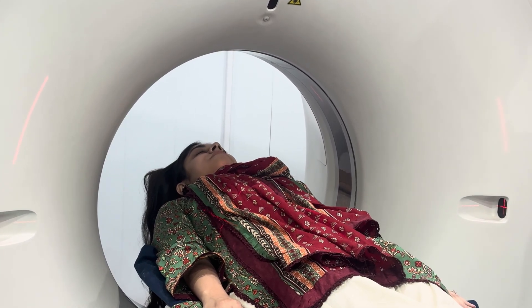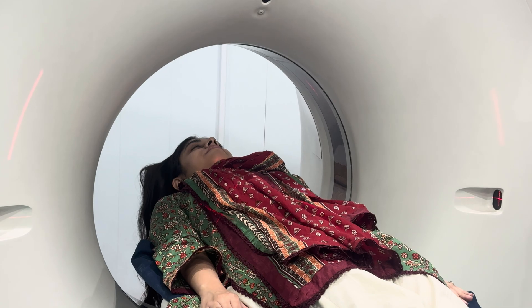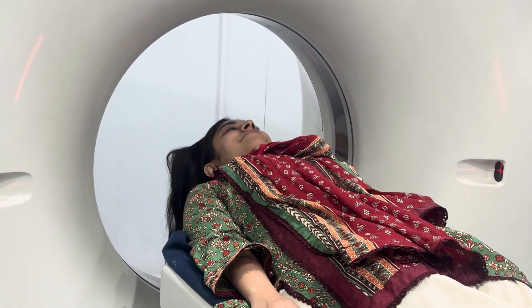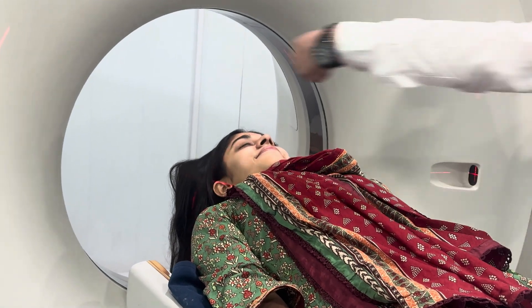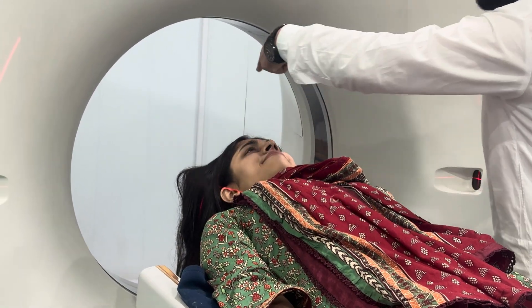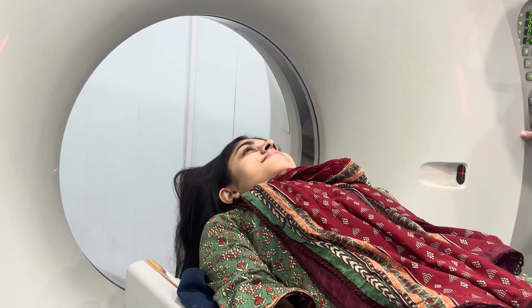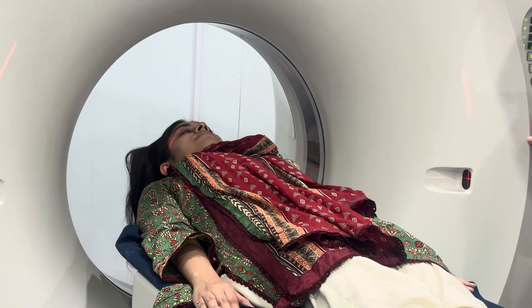Now let's move to the operating console for post-processing. The Toshiba Equilian CX machine console is used to generate advanced 3D images from DICOM data. It allows us to perform MPR, volume rendering, and MIP reconstruction — especially useful for complex anatomy like the cochlea.